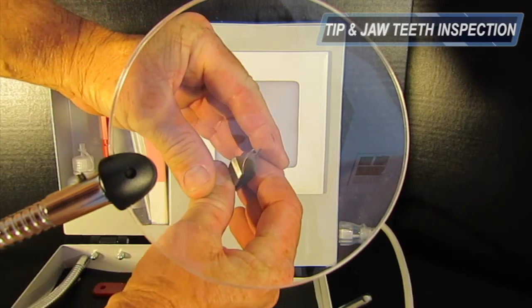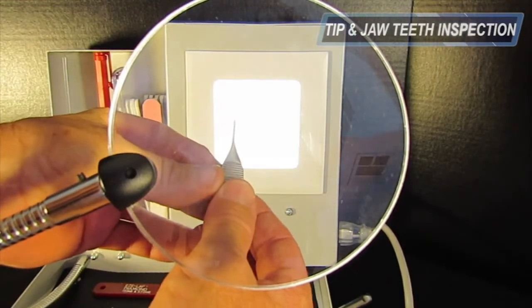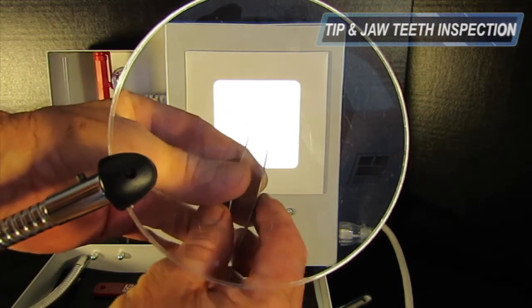First, inspect the tip teeth for proper alignment. Next, inspect the jaw teeth for proper closure using the backlight. Then inspect the jaw.